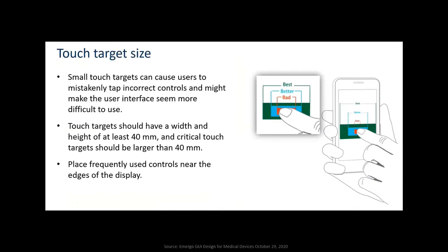Touch target size basically is, if there's a critical button there, make sure it's as big as it can be within limits.